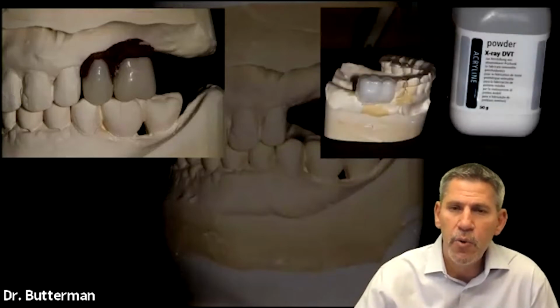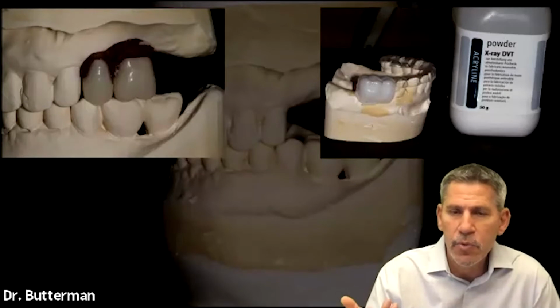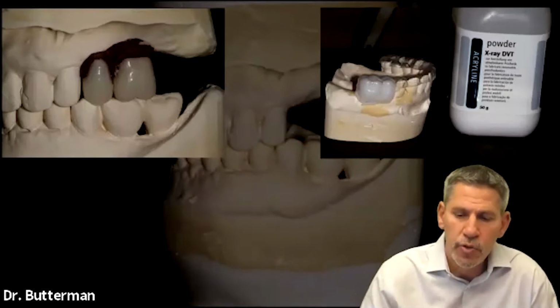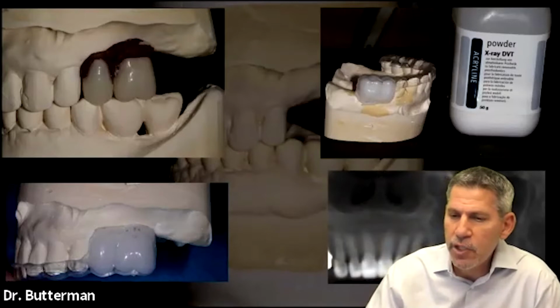And then you might say, okay, we need to take an x-ray and see where those teeth are in relation to the bone. So then you might ask the lab to make a barium sulfate scanning guide. So that's another couple weeks, another couple hundred dollars. And then after that's ready, maybe you'll send your patient off to have an x-ray taken.